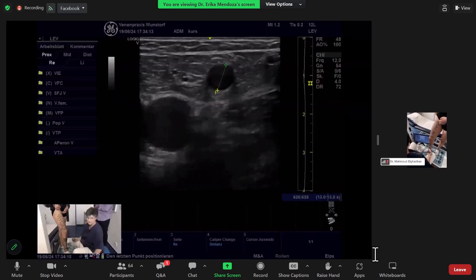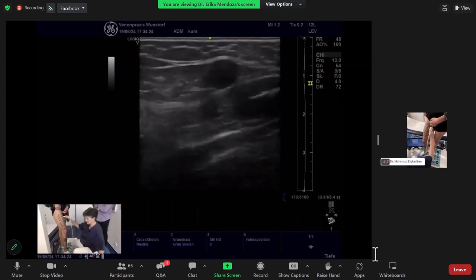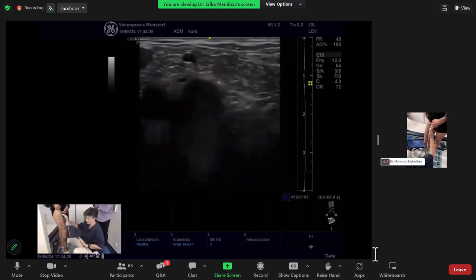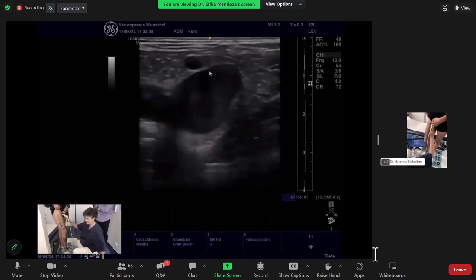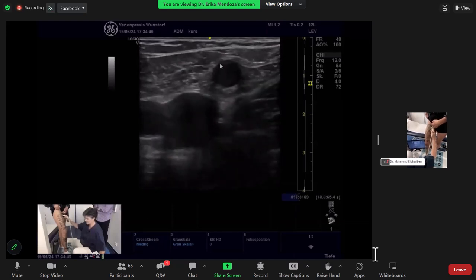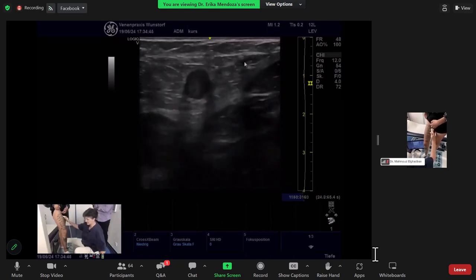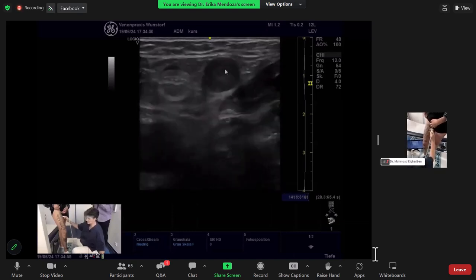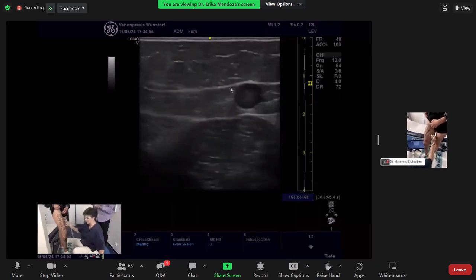These are 7 millimeters, which is like the edge of being too large. And I tilt the probe to the top. We see here an epigastric vein joining from lateral, or a circumflex perhaps. This is the great saphenous vein. We go down, this is another vein coming from medial, the pudendal vein possibly, joining in. And now I go down and we see what we have asked for perfectly.